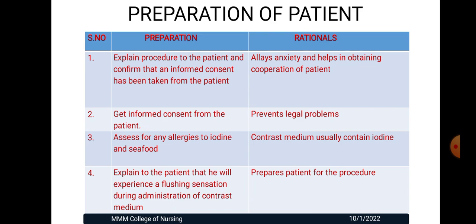Assess for any allergies to iodine and seafood. Contrast medium usually contains iodine. And explain to the patient that he will experience a flushing sensation during administration of contrast medium. It prepares the patient for the procedure.